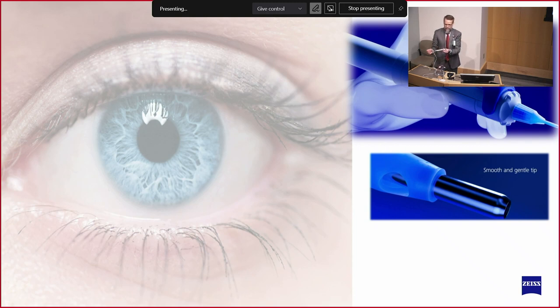There is no foot pedal. Your foot pedal is here. Position one is actually turned on right now by opening up a little clip. And you open up that clamp, you're in position one. Position two, equivalent aspirating fluid, is done through the first 50% of the excursion. And then the equivalent position three, where you're actively engaging with some, I'll call it pulsatile energy, is in that final 50%. So this is all that you're holding.